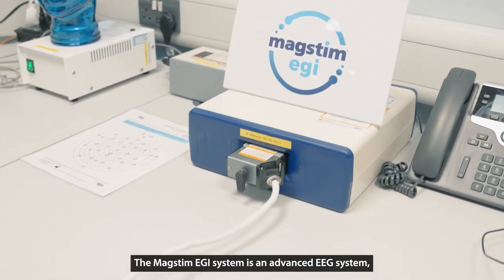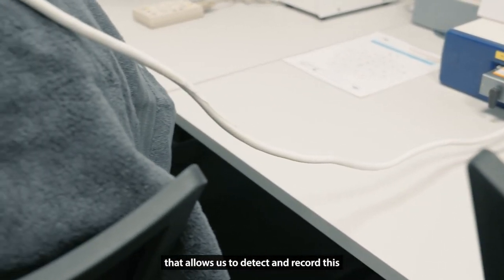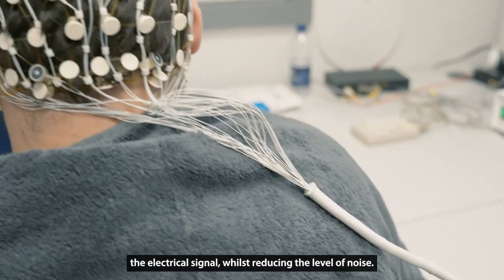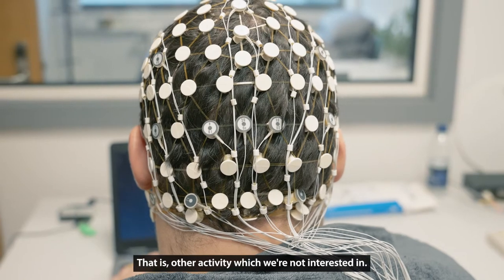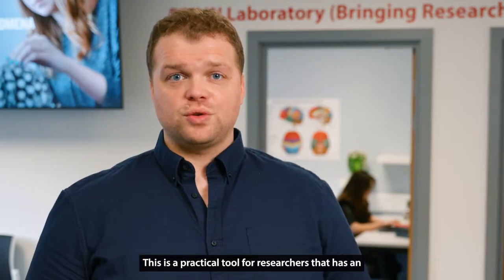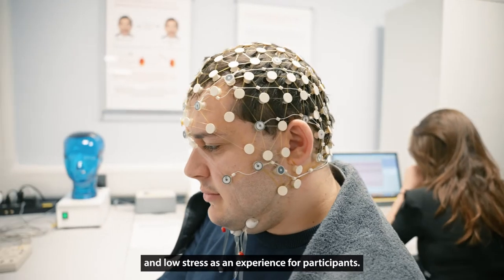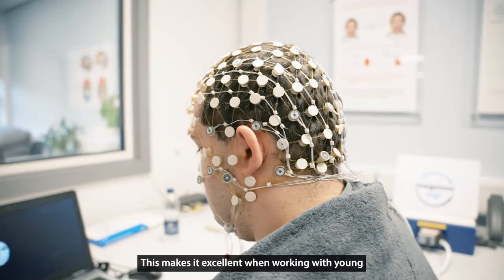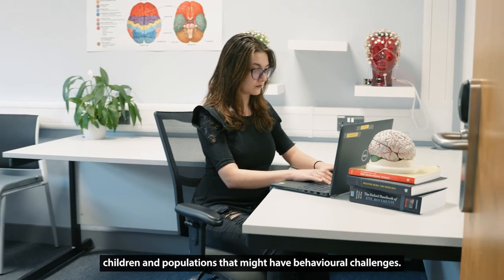The Magstim EGI system is an advanced EEG system that allows us to detect and record this electrical activity using an amplifier to amplify the electrical signal whilst reducing the level of noise — that is, other activity which we're not interested in. This is a practical tool for researchers that has an easy-to-apply electrode cap that is comfortable and low stress as an experience for participants. This makes it excellent when working with young children and populations that might have behavioural challenges.